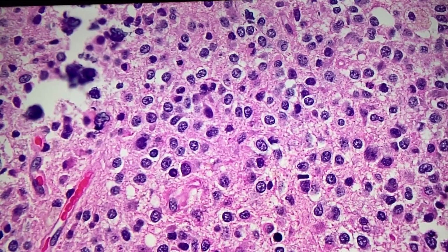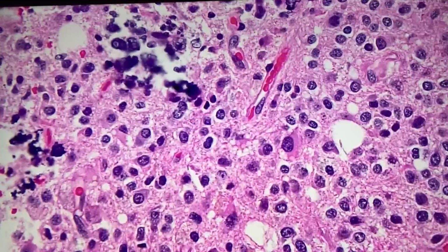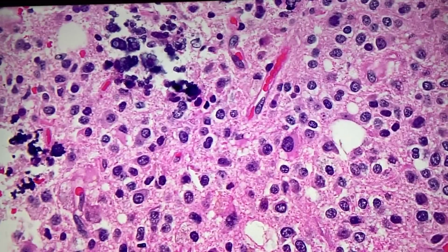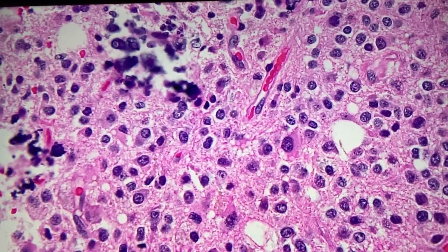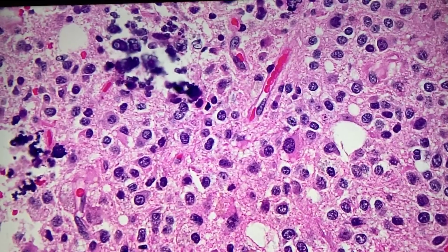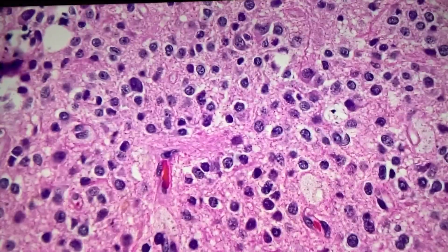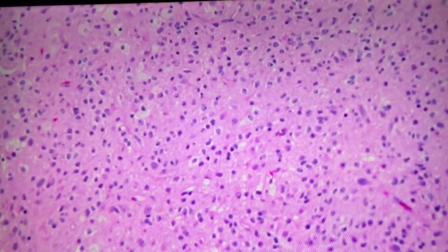Is there any significance to those? It's a soft feature of oligodendroglioma. Sometimes you see calcification in a slow-growing tumor like a grade 2 oligo. So is that what it is? That's what it is. There are some areas that show the vascular pattern. Okay. So we can go to those.